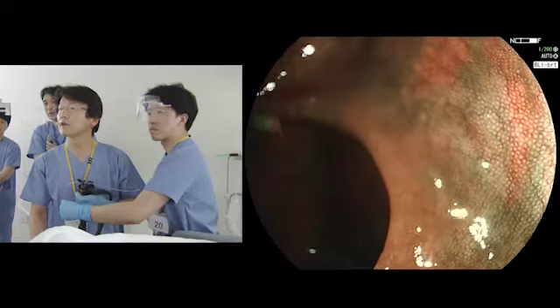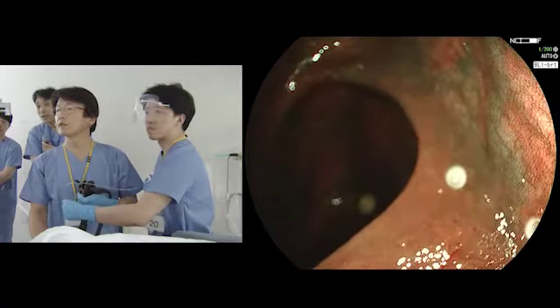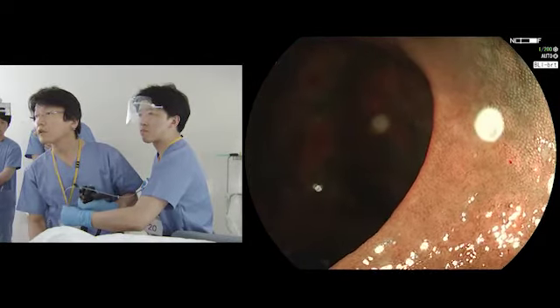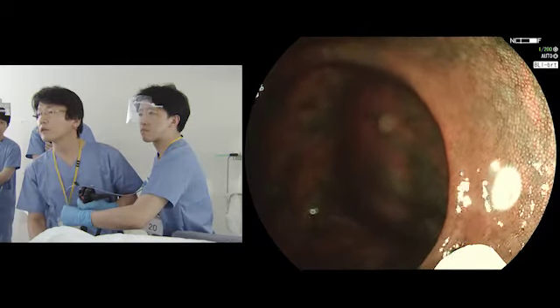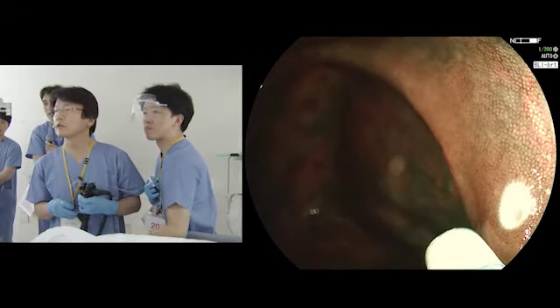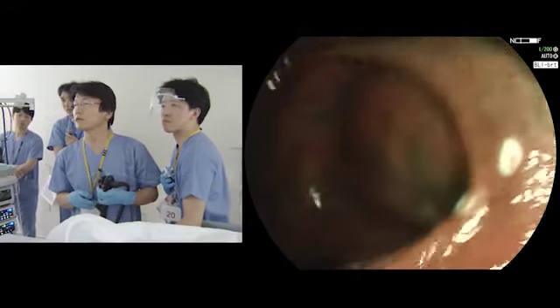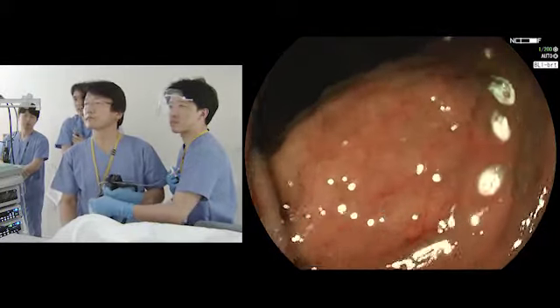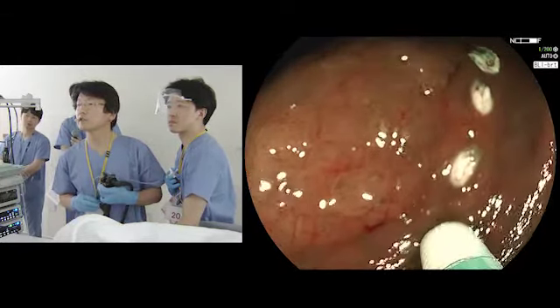So needle out. Yes. And here is the demarcation, so I think it's here. Okay. No, let me check. So when we use the magnification, we can see the type 1 pit of this normal area and then type 2 open pit of the SSAP.